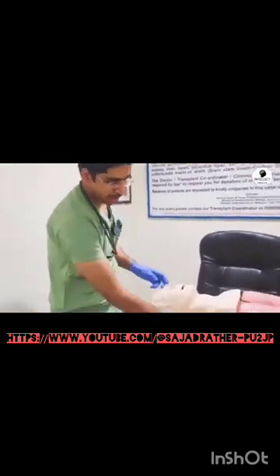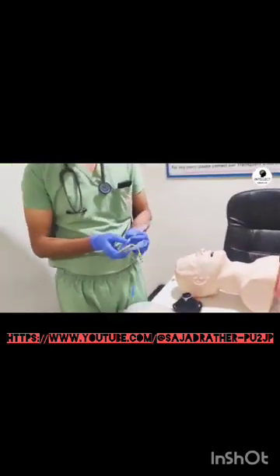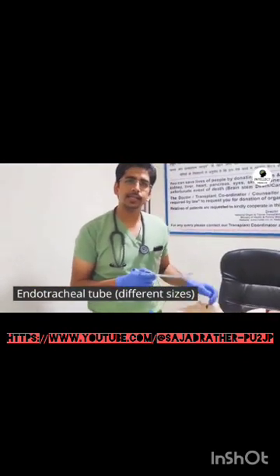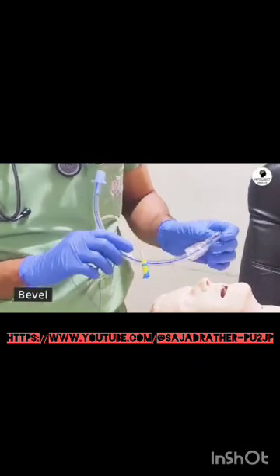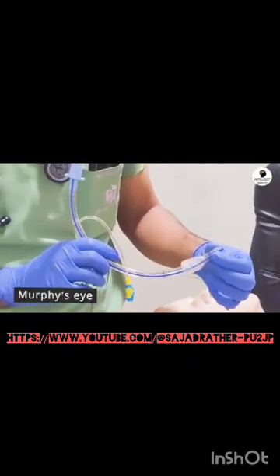Now coming on to the next thing, which is very important. This is the endotracheal tube, which we are going to insert inside the trachea of a patient. Endo means inside and tracheal means it is going inside the trachea. Now the parts of this endotracheal tube, first of all, starting from here, this is the bevel having a Murphy's eye so as to act as an alternative port.